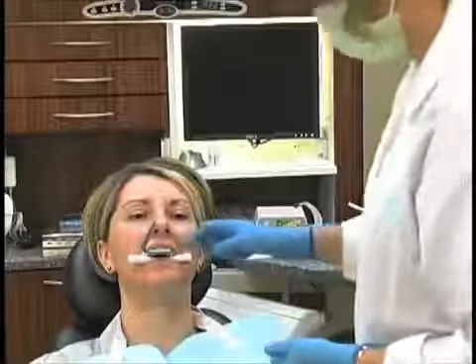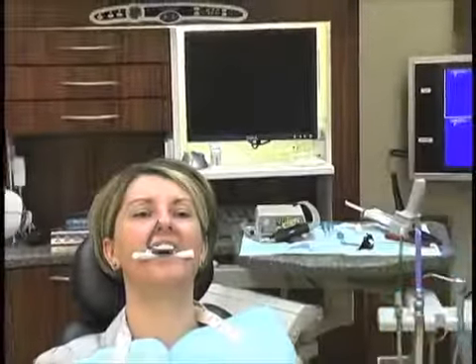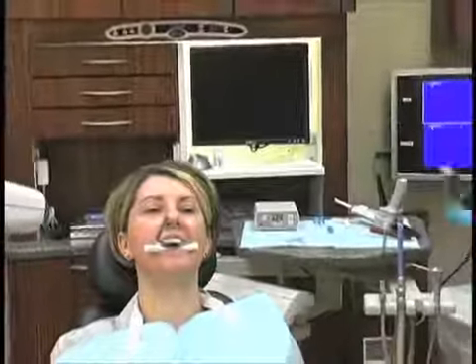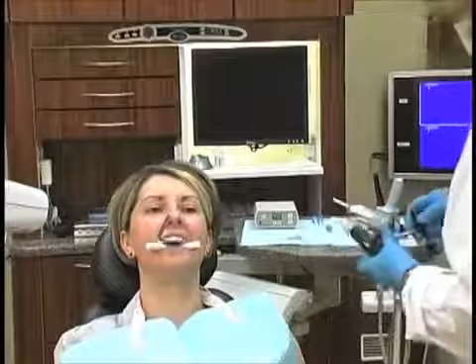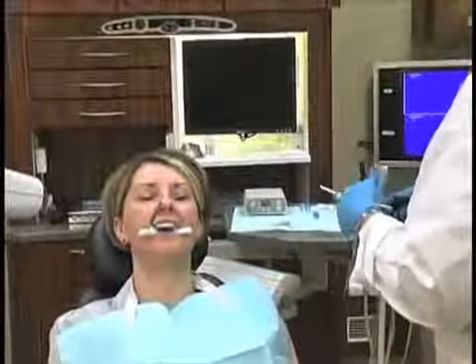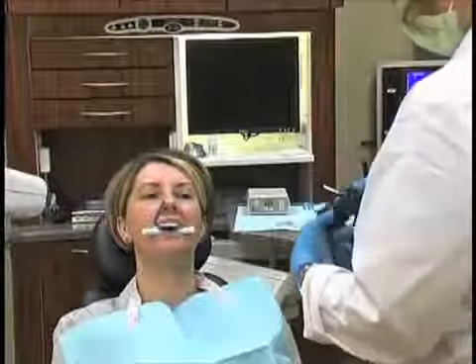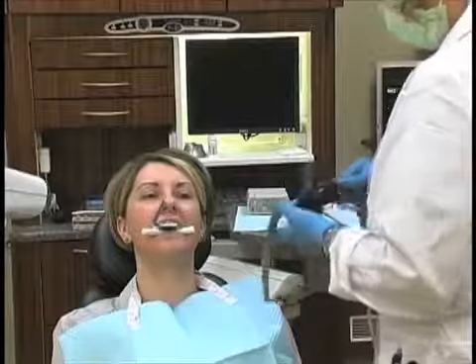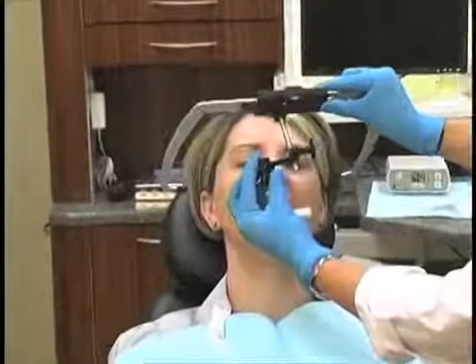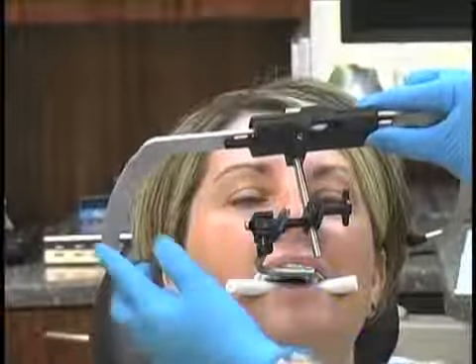So the next thing we're going to do, make sure that that's setting up okay, is get the ear bow. And we can go ahead and get the ear bow in place. Now the ear bow has two components to it. It's the part that's going to go in the patient's ear, and then there is the transfer jig. And the transfer jig is the removable part that you will become familiar with when we start talking about mounting casts. So what we're going to do now is attach the Facebow to the head, and notice the transfer jig has something that slides on to the bite fork.